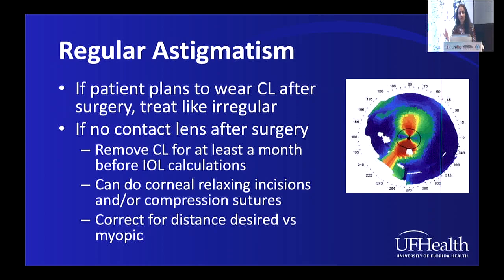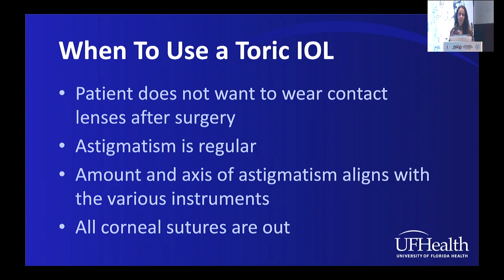And that, again, gives you a little bit of wiggle room because they can always move things if you're not right on the mark. We saw some of the talks about how to do measurements in irregular corneas, and a lot of these apply to the PK, so I won't reiterate those. But you do want to give yourself a little bit of wiggle room when you're doing these surgeries, because they don't always end up right.